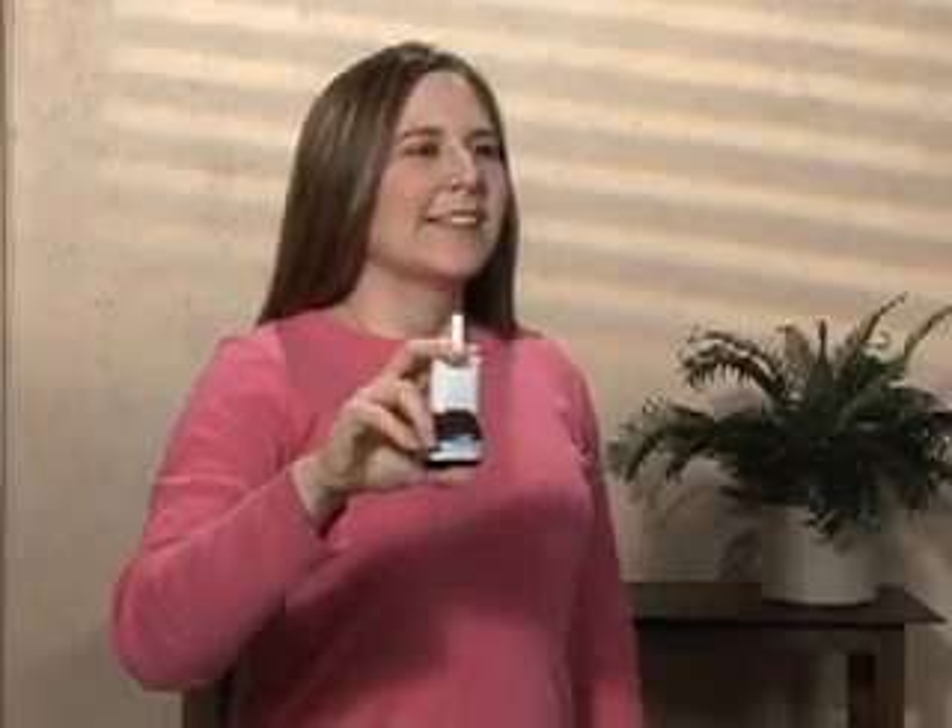When you're ready to use the inhaler, you must first shake it back and forth about five times. Exhale fully and completely through your nose.